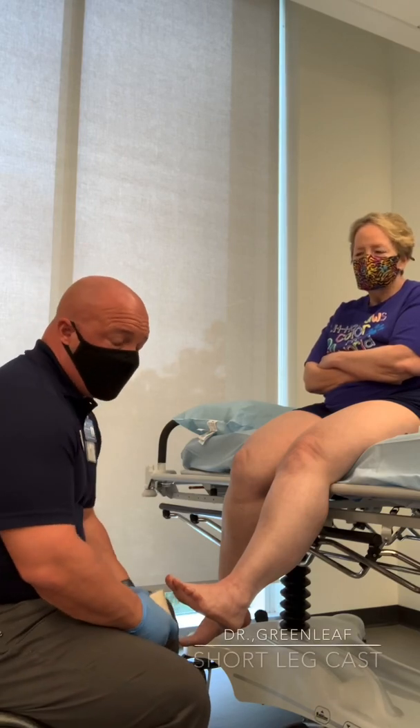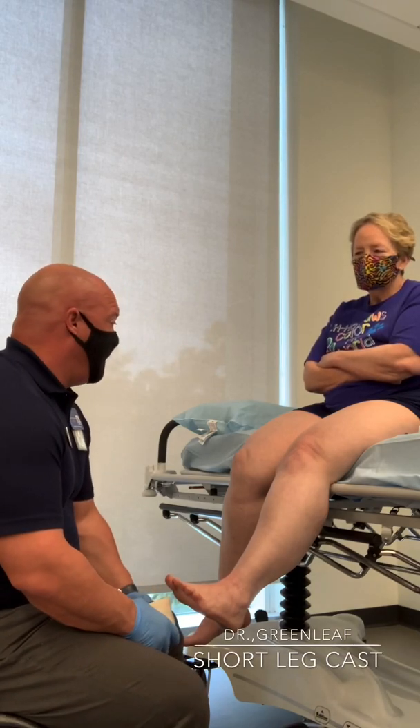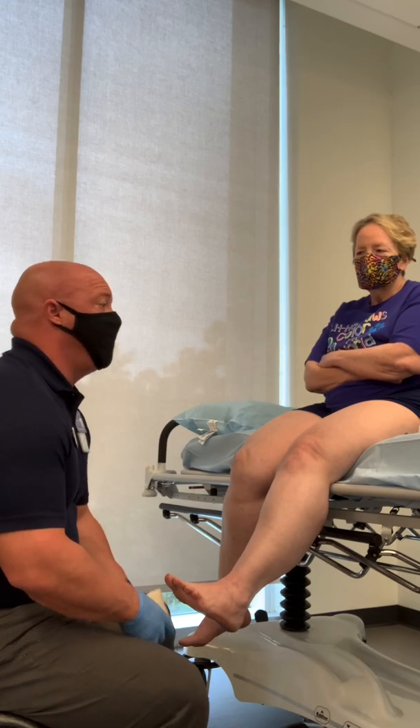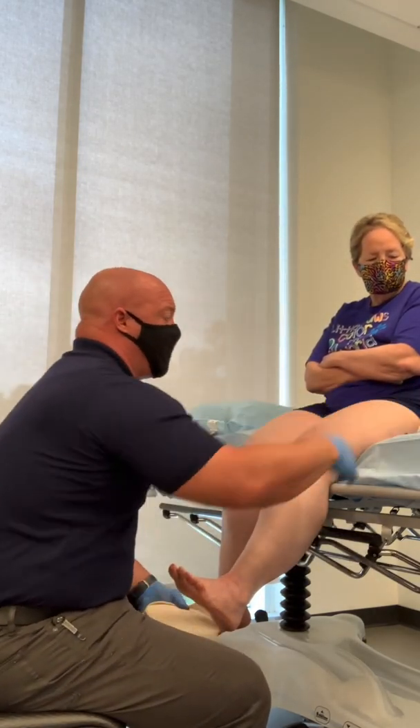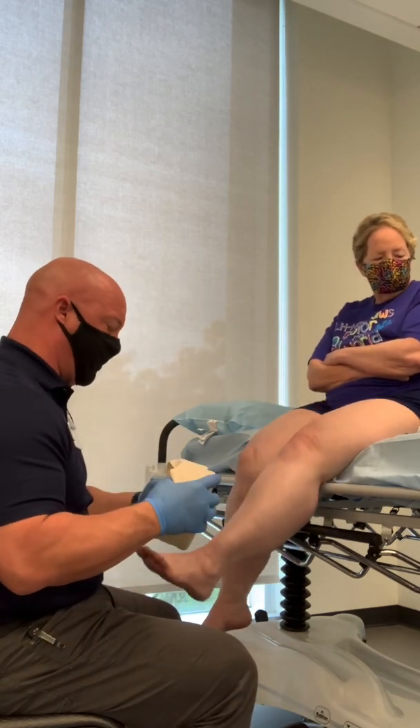Today we're going to do a short leg fiberglass cast using cast tape, 3-inch cast tape. This is McKesson. You can use 3M. There's plenty of products out there.